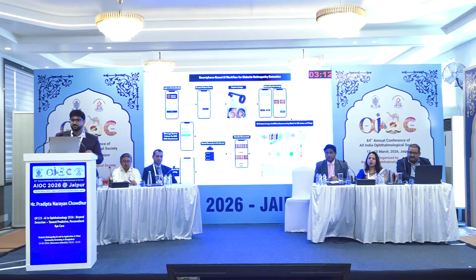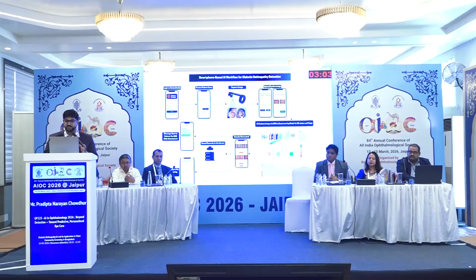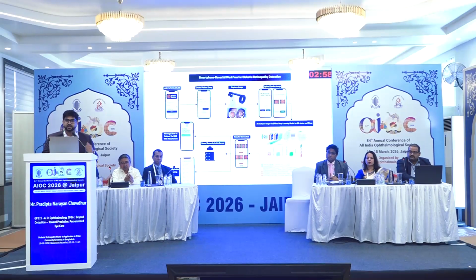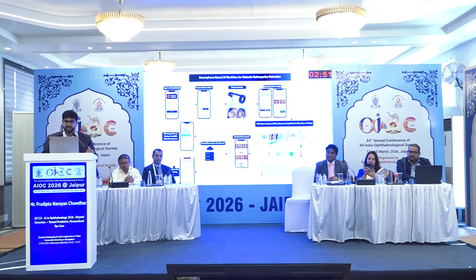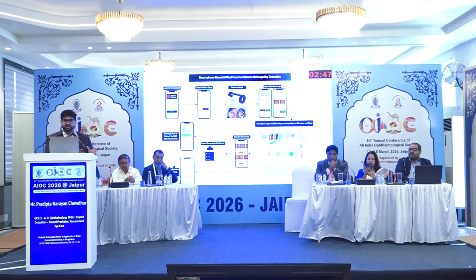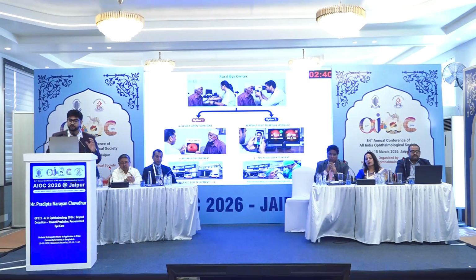Now we come to the second part, the workflow. We did it very simply. Nowadays, for better accessibility, everything has to be on the smartphone, so we built a smartphone application. You log into the app, create the patient entry, take the image with a portable fundus camera, and then upload the image. The AI analyzes the images and generates the results offline, and then the results can be sent to the patient by SMS, and are also saved on the server. Now for the second one, what's the workflow in our rural center?